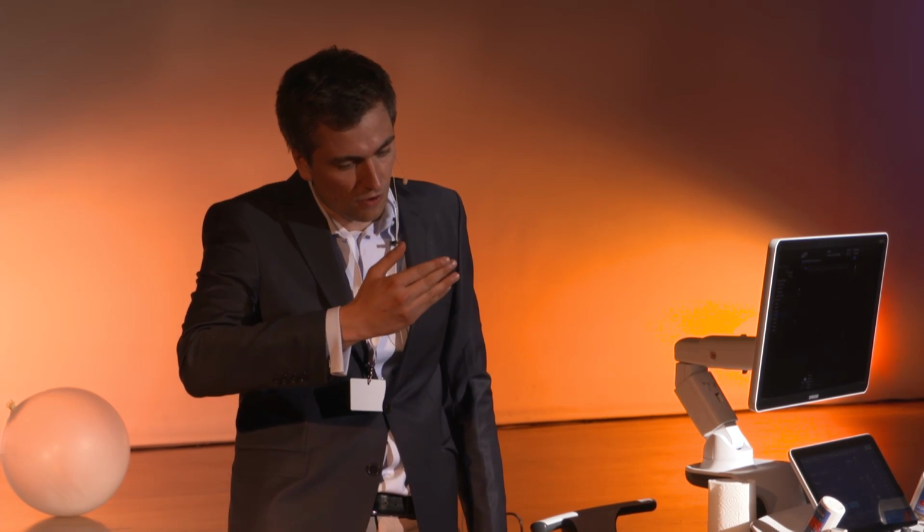And right now, we also talked about the handling of a probe, that you have to look on all structures, definitely in two planes. And you have to move from one plane, from the short axis to the long axis by just moving in one axis. And then you have to scan all the volume in two planes, and you can tell the structure.